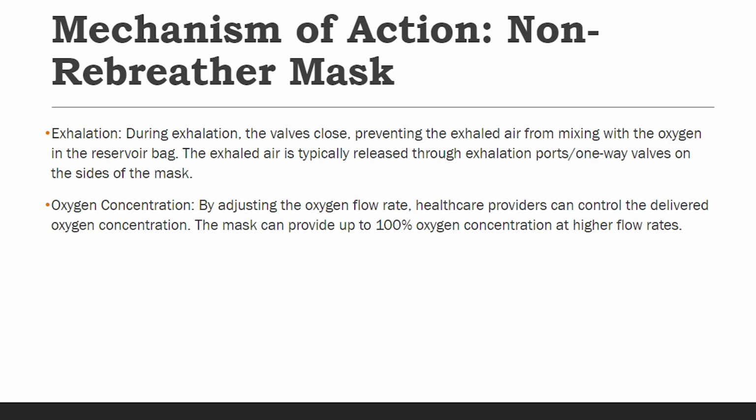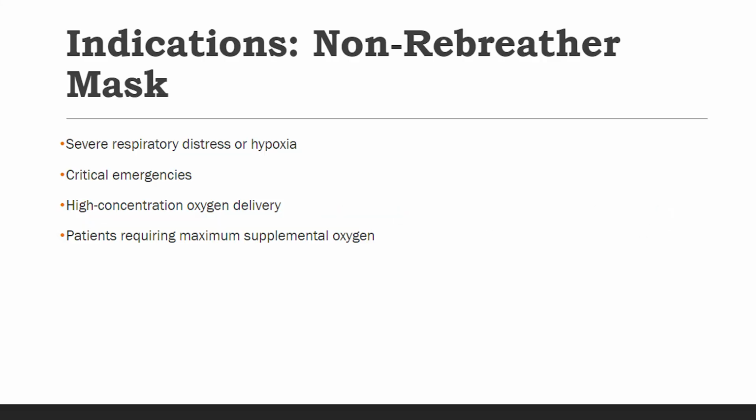It's important to note that while non-rebreather masks are often referred to as 100% oxygen devices, modern disposable non-rebreather masks typically provide approximately 70% oxygen. This is due to large air leaks around the mask body and through the open, or non-valved, exhalation port. This open exhalation port serves as a safety feature, allowing air breathing if the oxygen source fails, but can result in air dilution, or leakage, and variable FiO2 whenever inspiratory flow or volume are high.